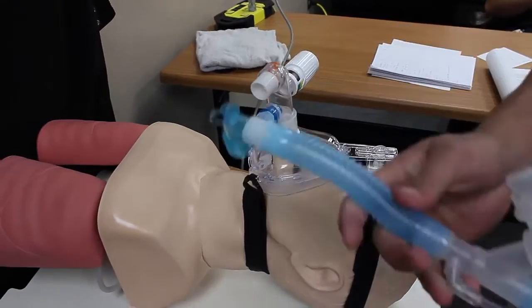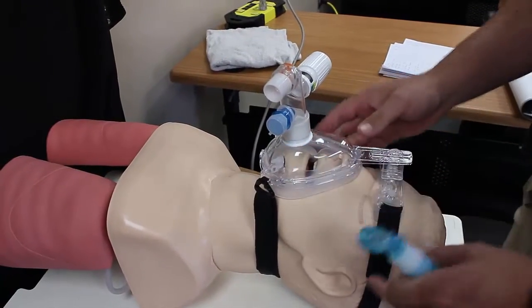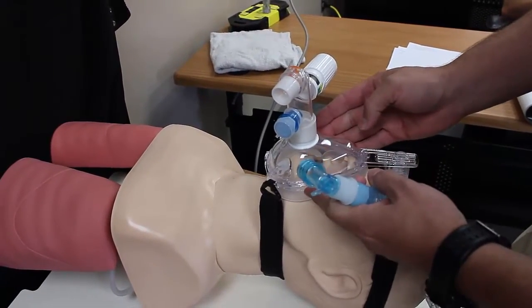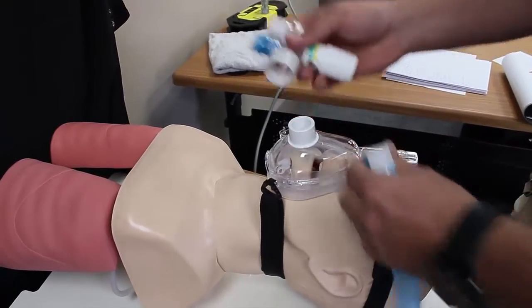We are now hooking up our Allied Ventilator to the BiPAP CPAP mask. Here we have a Suwannee County Fire Rescue EMS CPAP mask and I have to end up taking the extension piece off the mask.